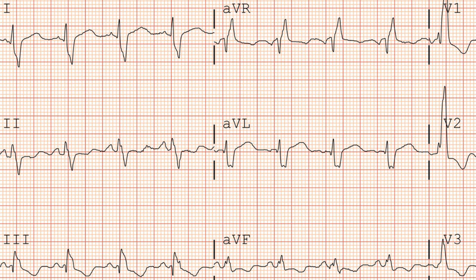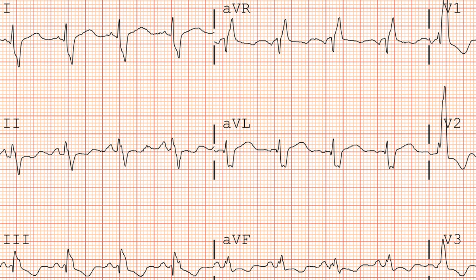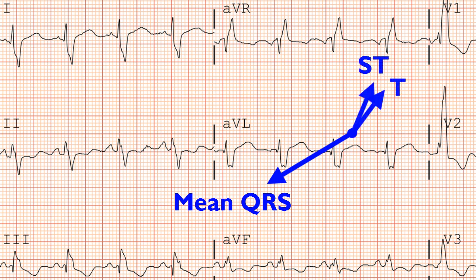Looking at the limb leads, for the most part these ST segment and T wave changes are typical of a secondary repolarization abnormality. The changes in lead 2 aren't 100% characteristic, but it's not a big deal if it's often one lead. The frontal plane QRS vector is oriented rightward, consistent with right axis deviation, while the T wave and ST segment vectors point nearly opposite to it on the left side — typical of a secondary repolarization abnormality from a bundle branch block.